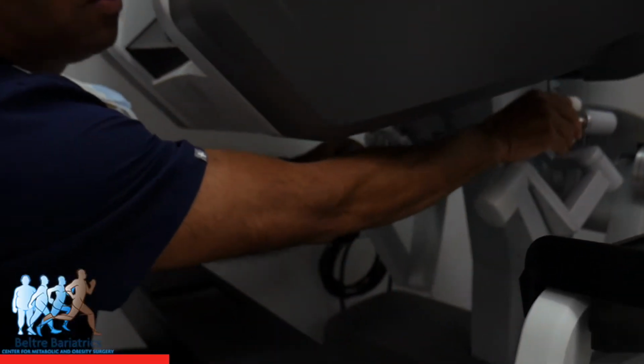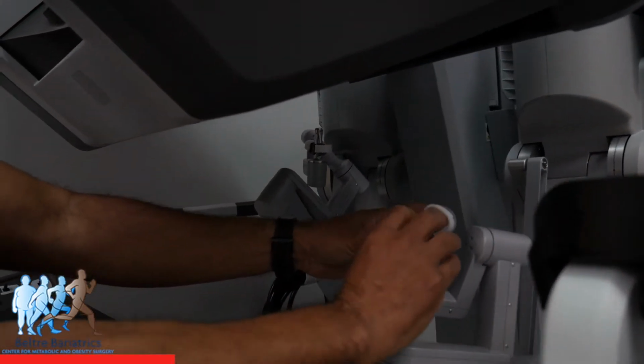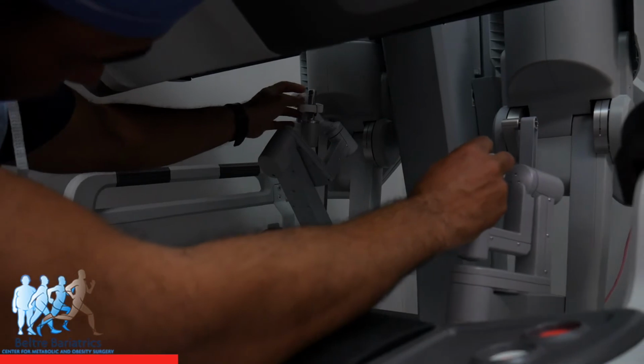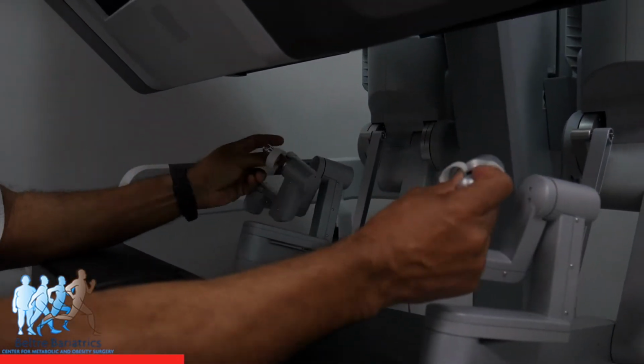These are the controls for the robot, okay? I put my fingers through it, okay? And I'm controlling the instruments, different movements of the robot, very fine movement.